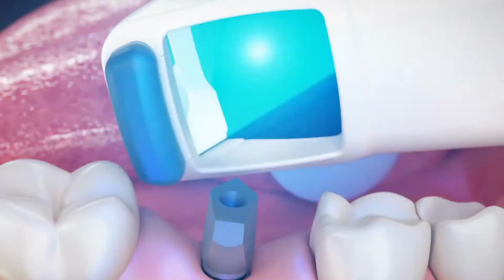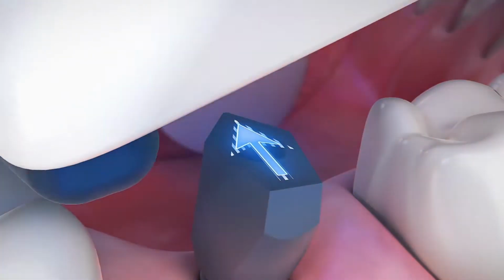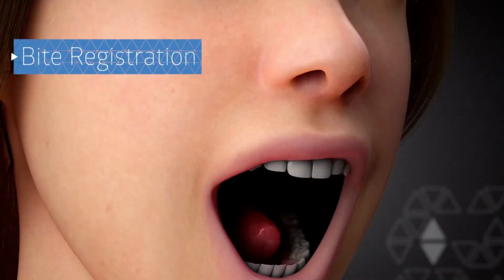The second scan is with a scan body attached to each implant. The scanner is programmed to recognize the scan body, so it should be placed with the pointed area facing the lingual side. Press the push button once to stop the scan.